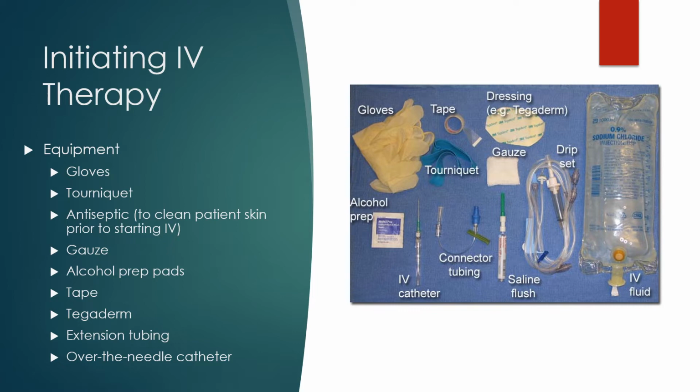So making sure that you are putting that on as soon as it can be released, releasing it as quickly as possible. You also have to be aware that that tourniquet can have a pinching or twisting motion. So remember, on our older adults, they have that really thin skin. So making sure you aren't tearing their skin or bruising their skin. Maybe, if they have a short sleeve, you're putting the sleeve under it, or you're putting a washcloth under it, or something so that we can have that protective barrier when we're thinking about that elderly, thinner skin.